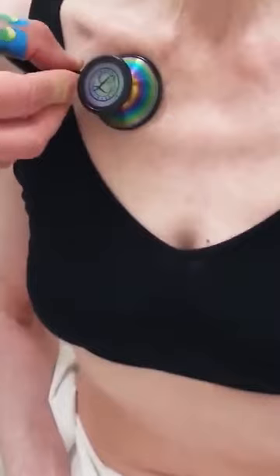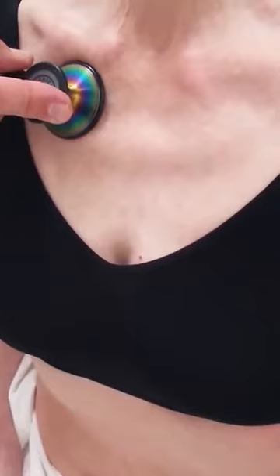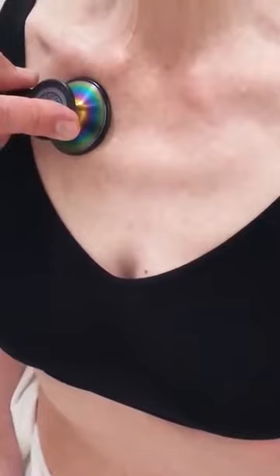In a few minutes we're going to talk about auscultating for carotid bruits. This is one of those situations where, if you hear a murmur that's relatively loud and are concerned about whether it transmits, you should be thinking about aortic stenosis or aortic insufficiency. We will then move superior to this position to auscultate for carotid bruits.